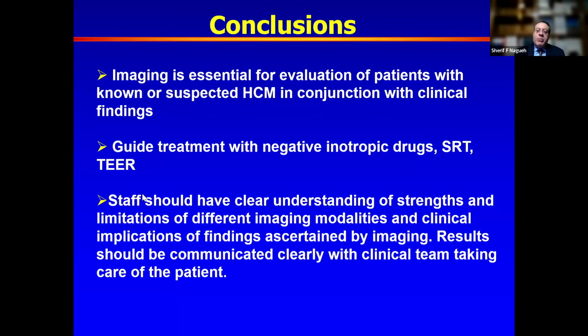So for all patients, with or without variable degrees of obstruction, I want to scan to show the mitral regurg. I want to align with the mitral regurg itself, not with the gradient, like I showed you in some of the examples. So the reader can see what is the peak velocity for that mitral regurg jet. And then try my best to align with the LV outflow tract, guided perhaps by colored Doppler, but also doing a sweep from the LVOT to the LA, where we transition and we are able to show maybe the gradient by itself, superimposed gradient in MR, and then the MR by itself.